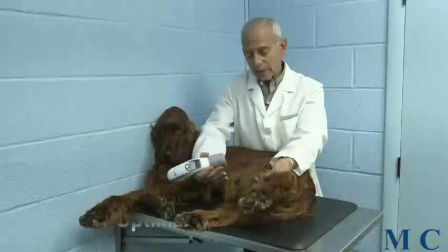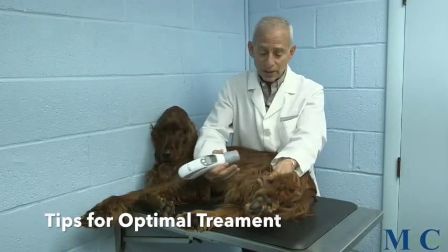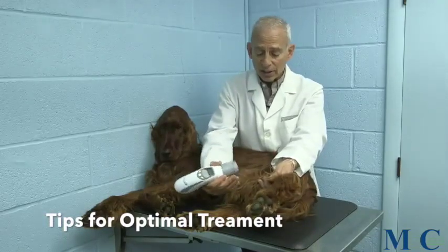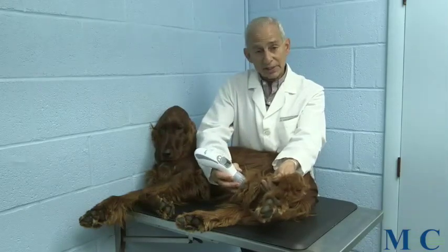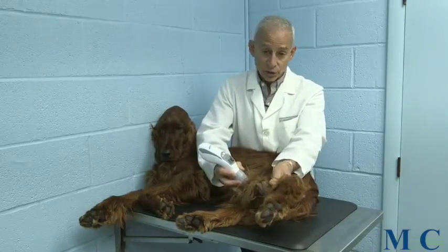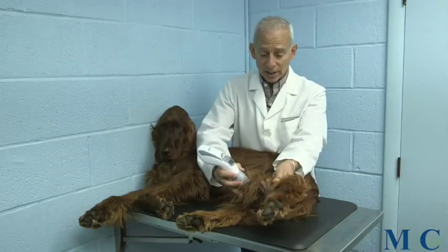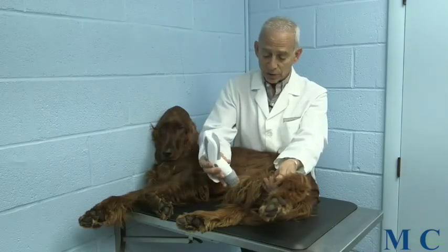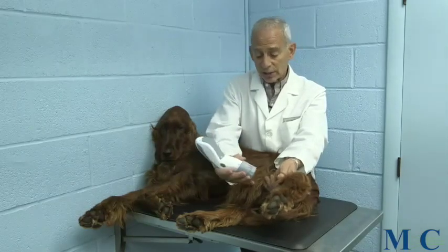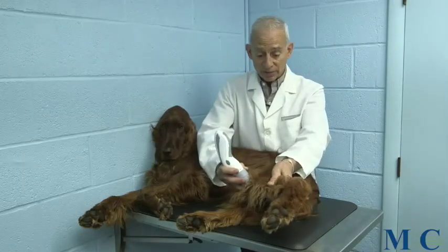A couple of things that are very important. First, you want to make sure that you get all the fur pushed out of the way. For example, if we're treating his knee, you want to move as much fur out of the way as you can so that when you place the unit, it's in good contact with the particular body part you're treating. The important thing is that you get maximum contact with the skin and are able to apply a fair amount of pressure.